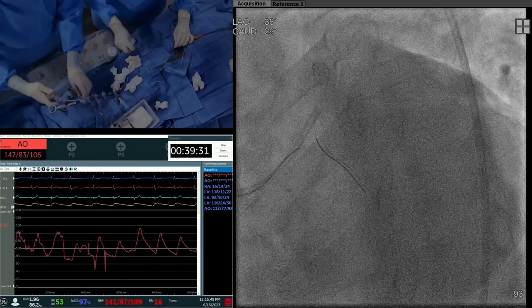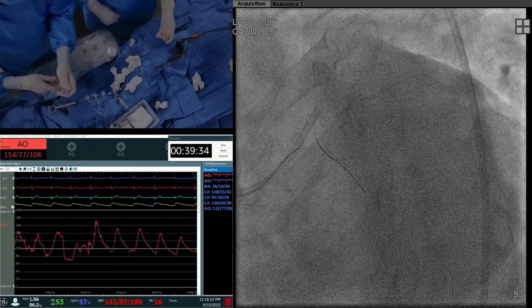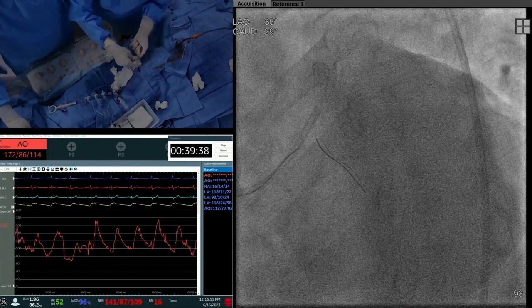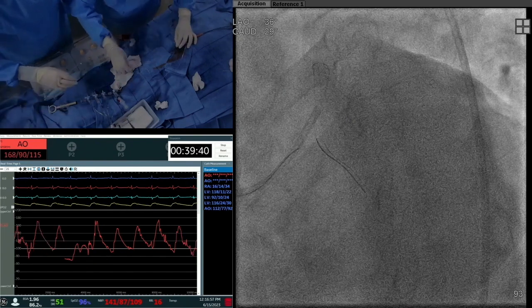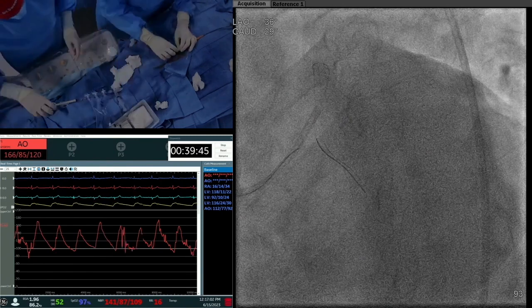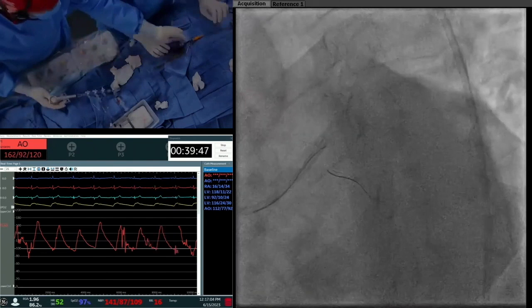Okay, let's take a picture here now. And then we recross, kiss, IVUS. And then you'll tell us if you nailed the ostium. What's going on in the other room? They are ready also for you.